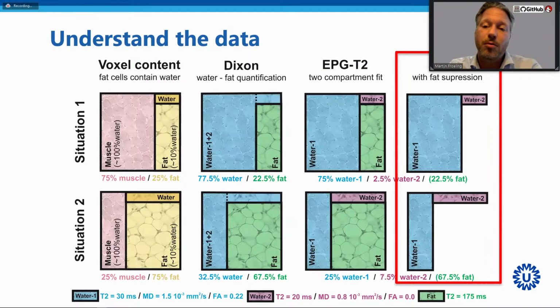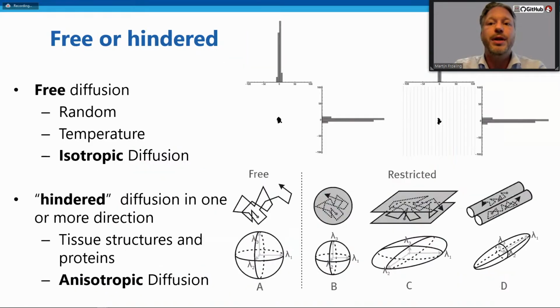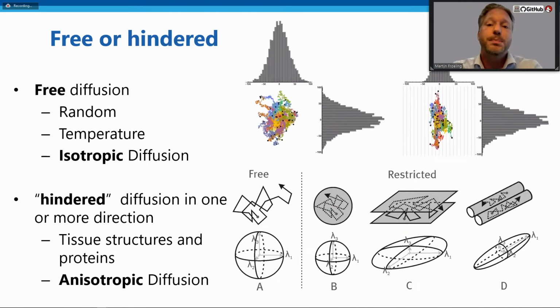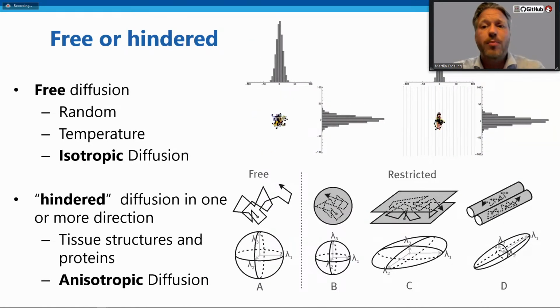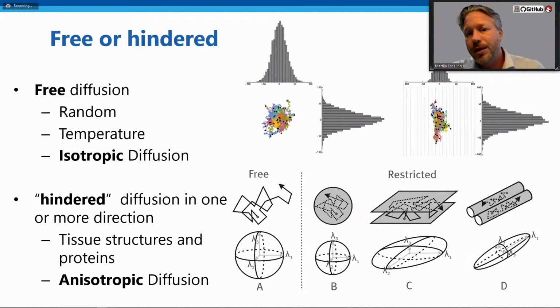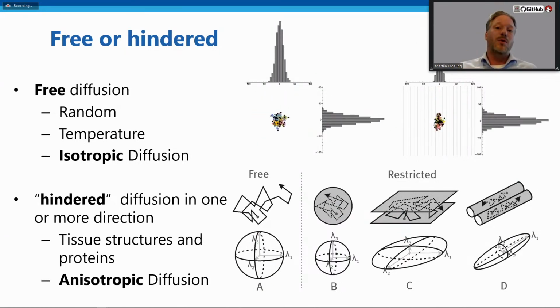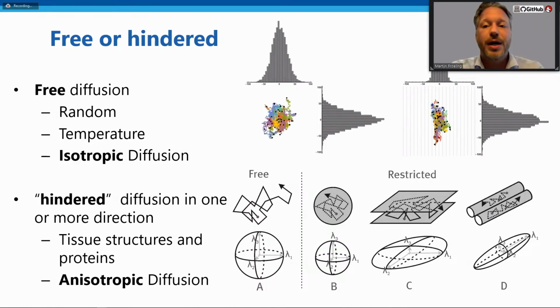The last technique I will be showcasing is diffusion weighted imaging. So in every cell there's water, and water moves around due to temperature. And if there's cell membranes, the diffusion is not isotropic in all directions. So therefore we can get sort of a distribution of the likelihood that water moves a certain part. And then we can actually measure that with an MRI machine.